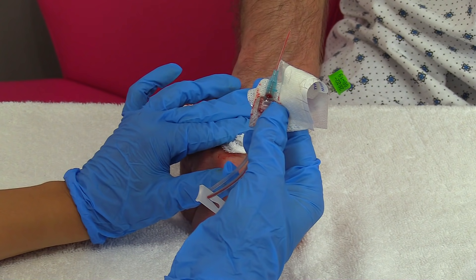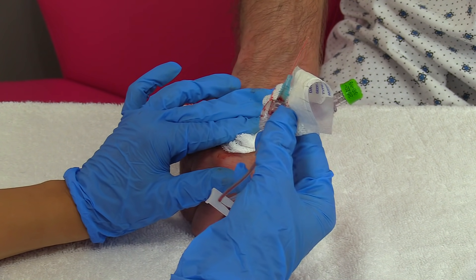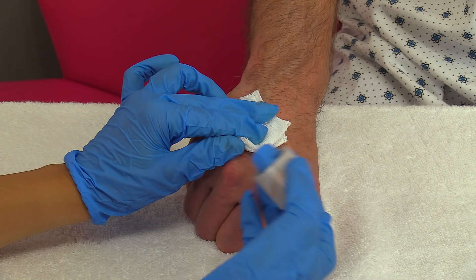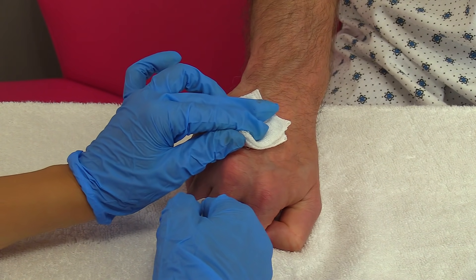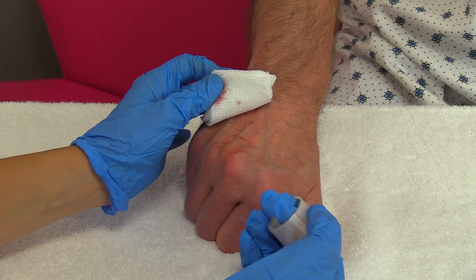Dispose of the cannula in the receptacle area that your facility requires. Then once you've held pressure for the appropriate amount of time, lift up the gauze and make sure the site is not bleeding anymore — our site looks great.